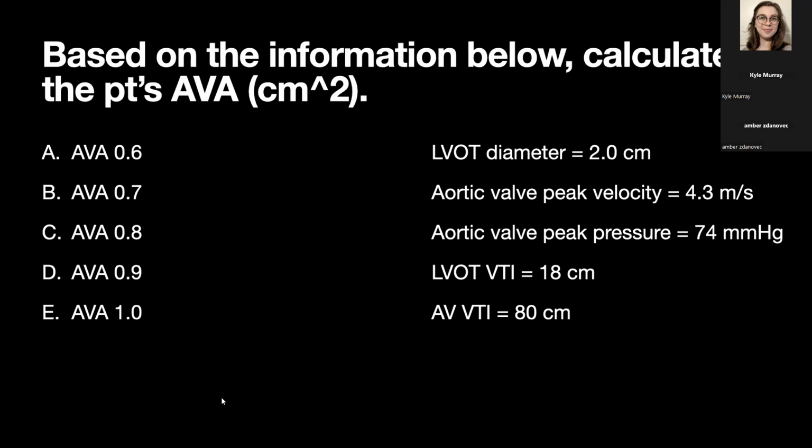Anyone? I got B. All right, we got a B. Anyone else? B. Got two B's. All right, we'll go through it. So B is the answer.